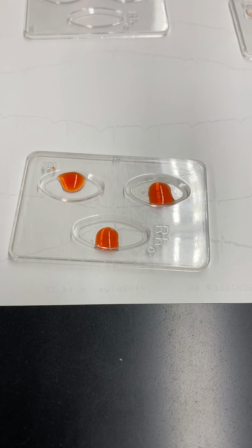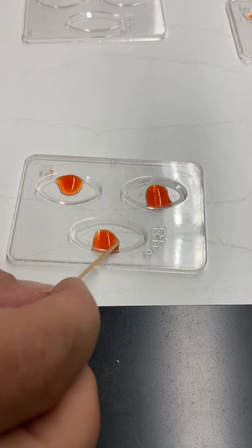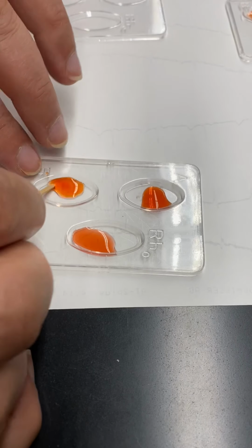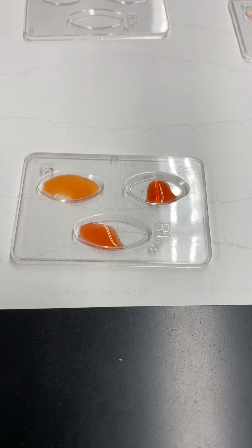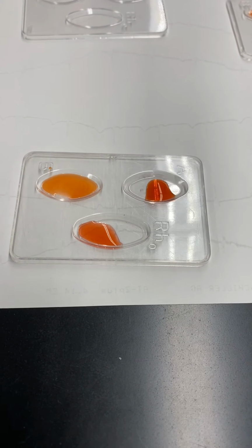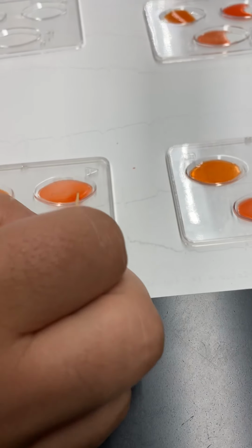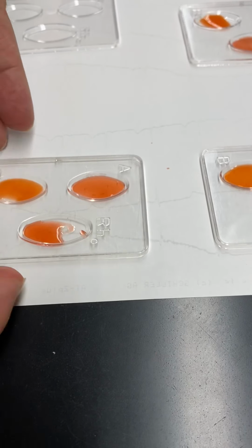Same process repeated. So here is one sample. Here is another one. And here is our third sample. So again, we're looking at any significant changes in our blood sample.